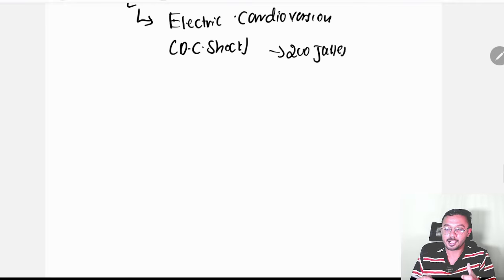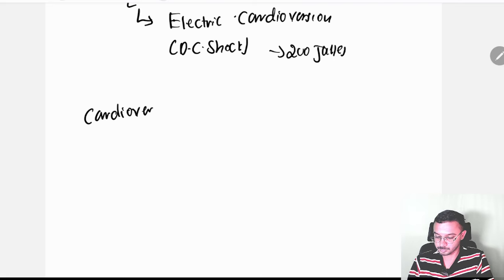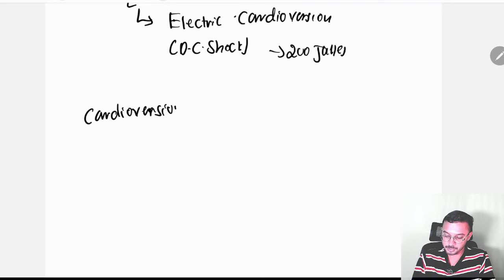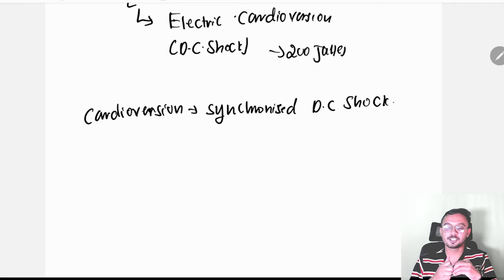In cardioversion, you are going to give a synchronized DC shock. What do we mean by synchronized DC shock?